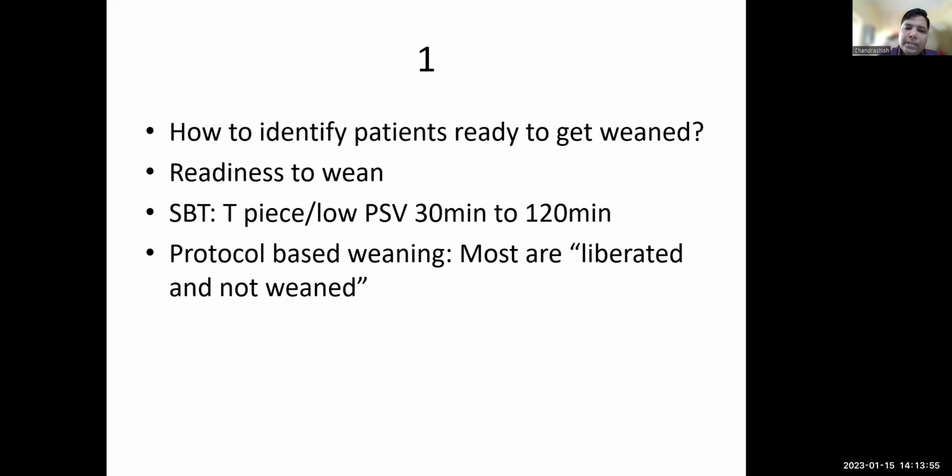But there are ways of protocol-based weaning, usually done by respiratory therapists where they are available in the world. We don't have them in most of the Indian hospitals, but nowadays in some of the hospitals they are coming to work. So every morning they are supposed to look for readiness to wean.